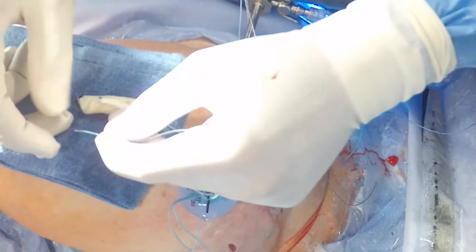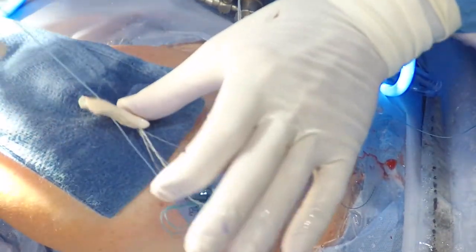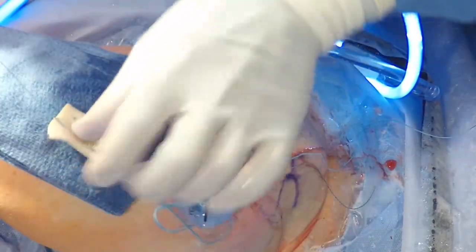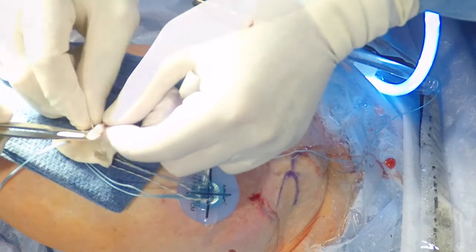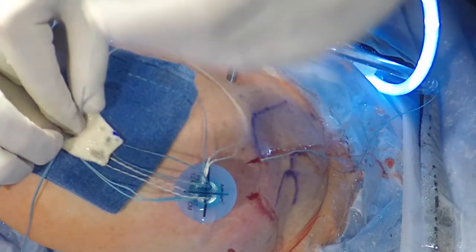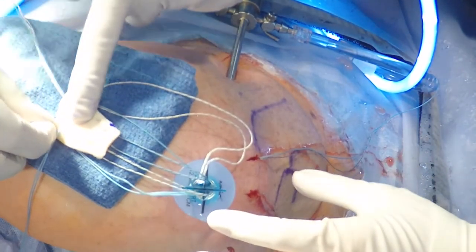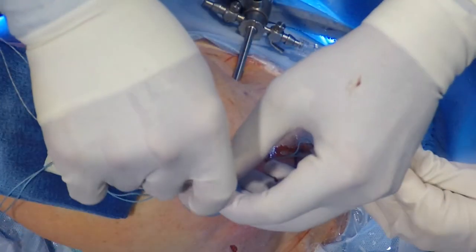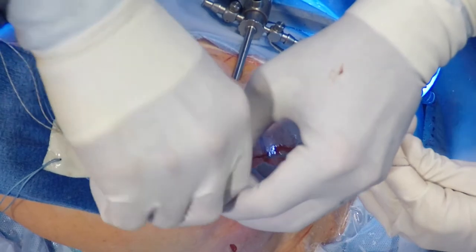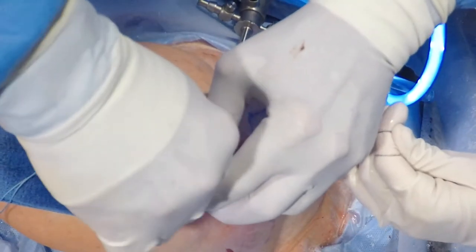The sutures from the medial row on the tuberosity are now passed through the holes that we previously made, ensuring that we have the correct quadrant so that we are maintaining the sutures in the appropriate orientation. You can see clearly here that the sutures are well-organized, and that really requires working as a team in the operating room to achieve that. Once we've done that, we can now remove the device that was separating the entryway into the four quadrants.